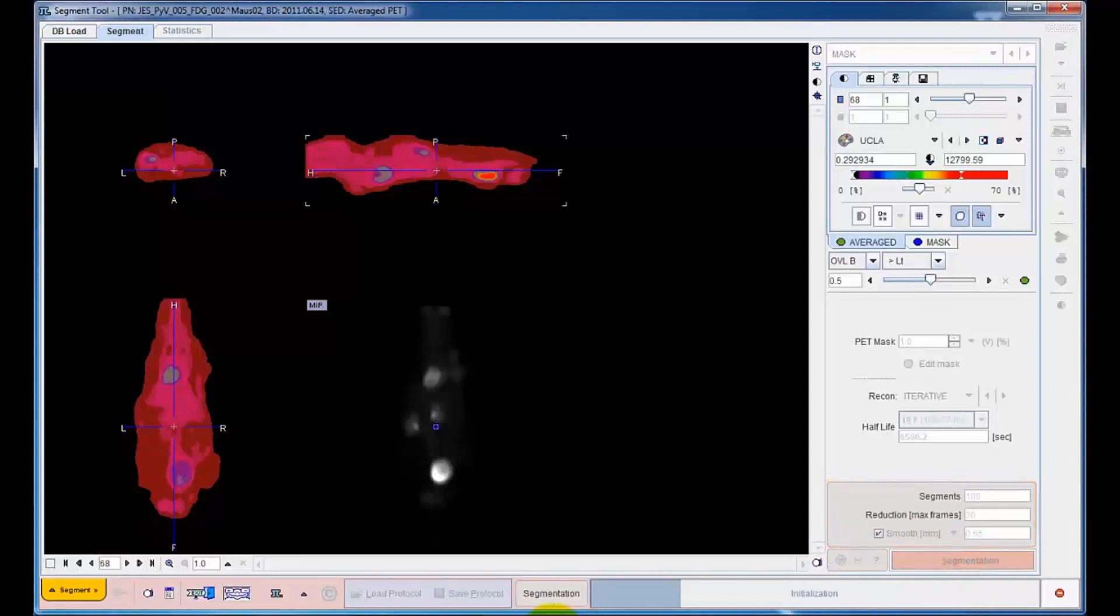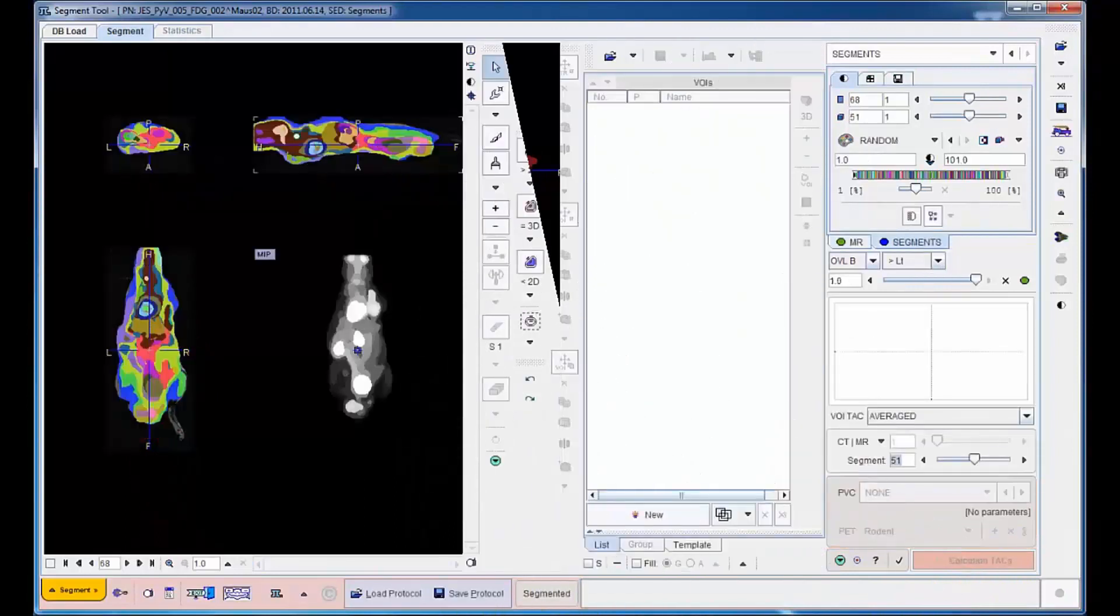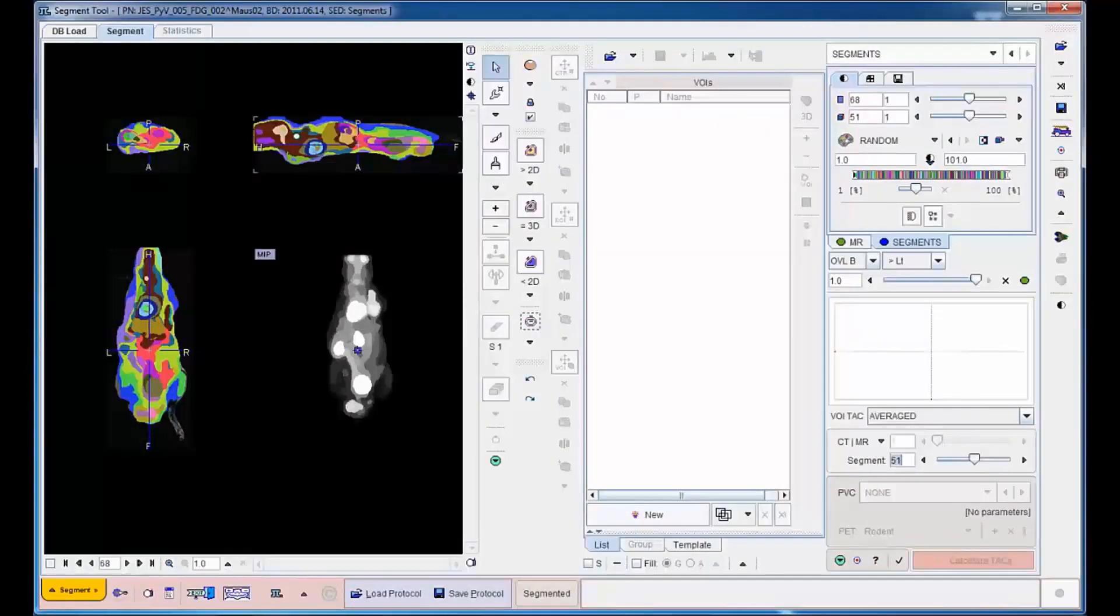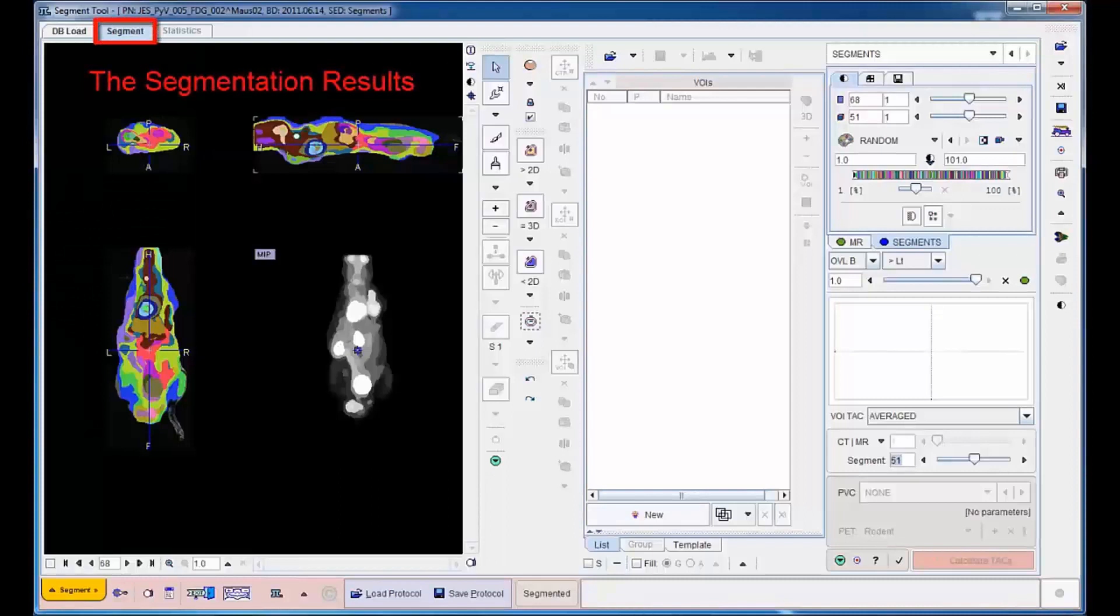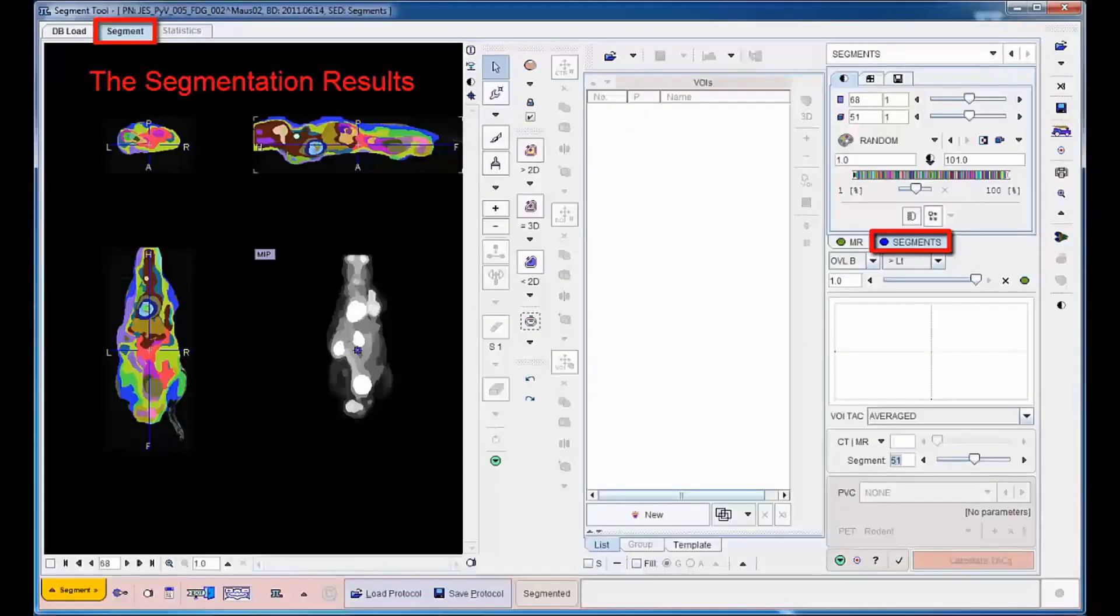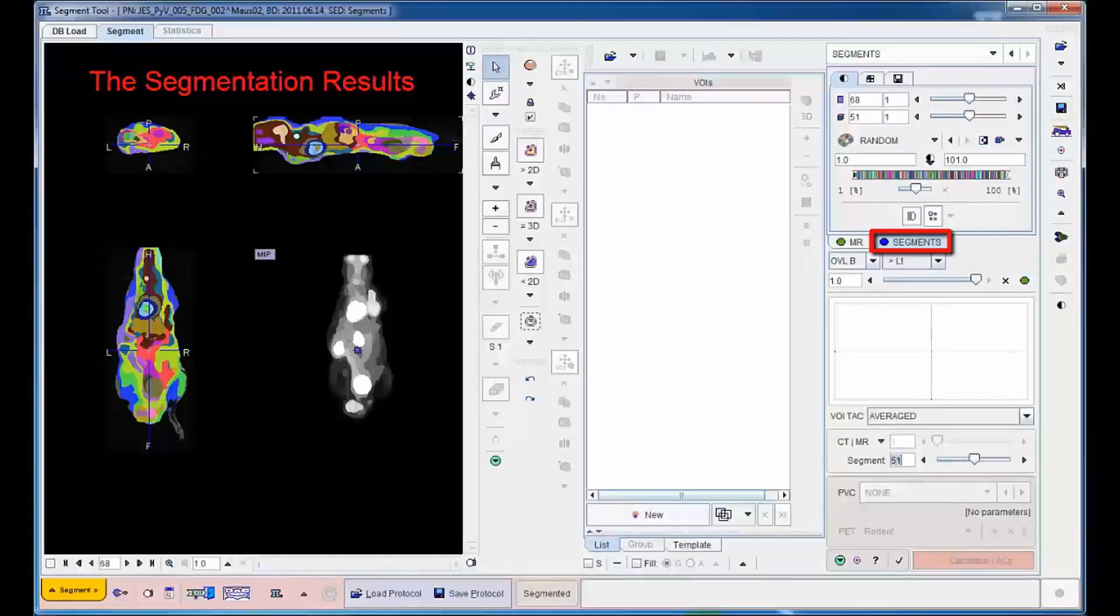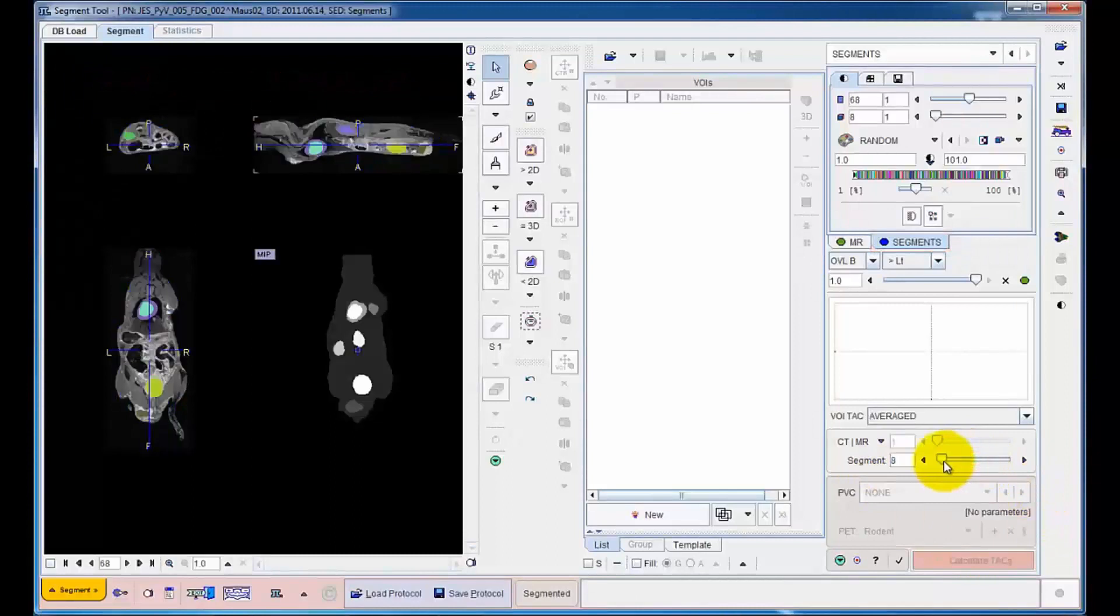After a few minutes of calculation, the results are shown on the main segmentation page. The segments appear as distinctly colored patches. Using a slider, the number of segments in the decomposition can be adjusted.